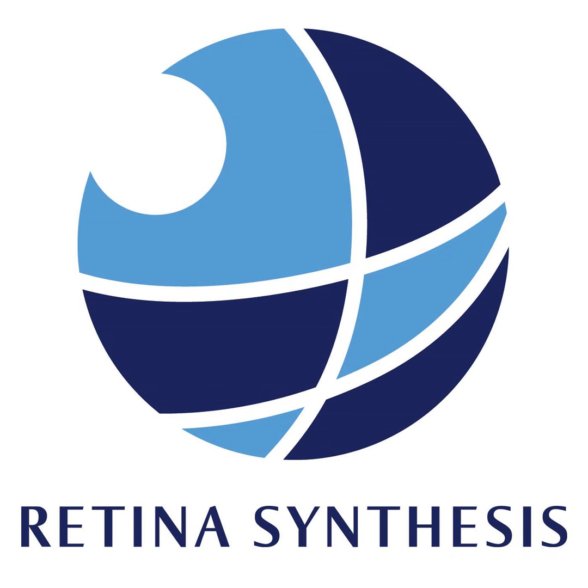And with swept source OCT, the imaging has gotten even better, and we've validated our algorithms that allow us to image drusen. And not only that, with en face imaging, we can now visualize the evolution of drusen to geographic atrophy. One of the first steps when drusen start developing atrophic changes is the retinal pigment epithelium overlying the drusen starts breaking down. And I remember we observed this with spectral domain 15 years ago, and that is as the retinal pigment epithelium breaks down, you start getting what we call hypertransmission defects.